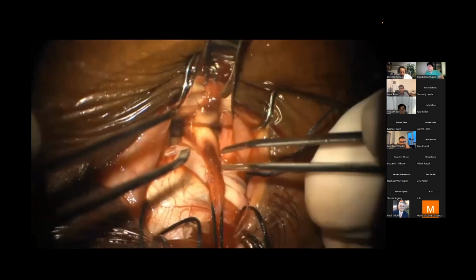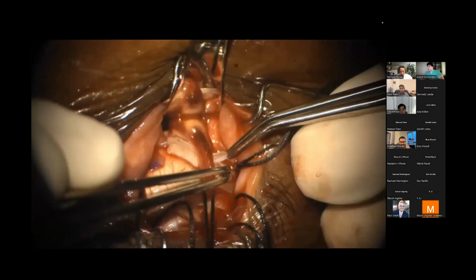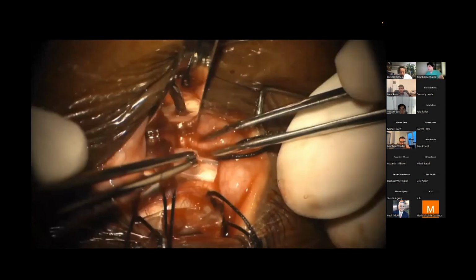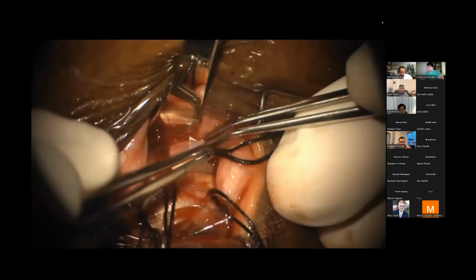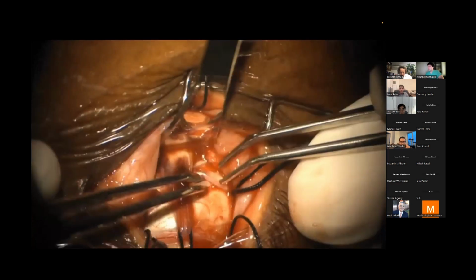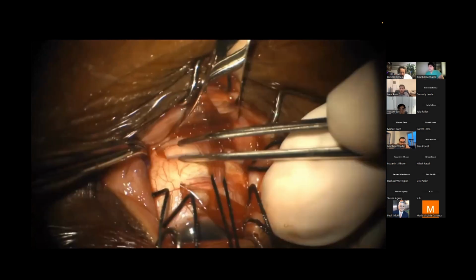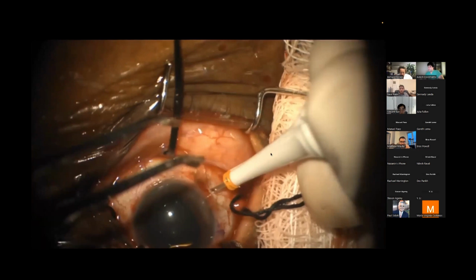Neal, can I just interject real quick? Yeah, absolutely. So just a question, because I know you were doing this with Dr. Landa, but because you're doing a vitrectomy, is this why you're not going to mark the breaks? Is that the idea? Yeah, I think so. Just because we know we're going into the eye, and I think we have a good thought that this buckle element should ideally cover that area well. And then we saw it snap into place there, and it did fit pretty snugly, even though the encircling band was a little thinner than the usual 240 band.